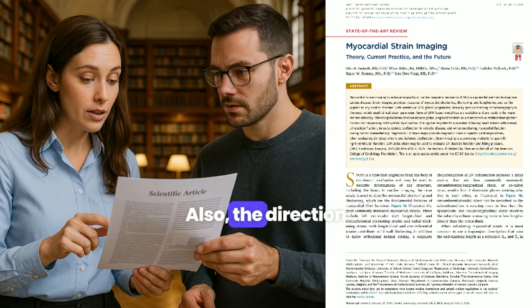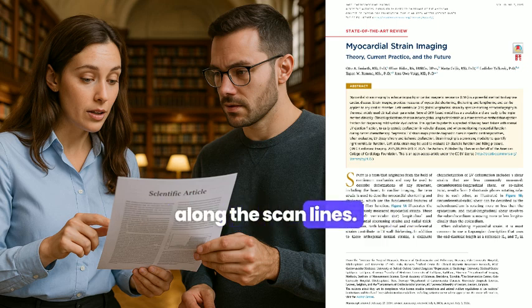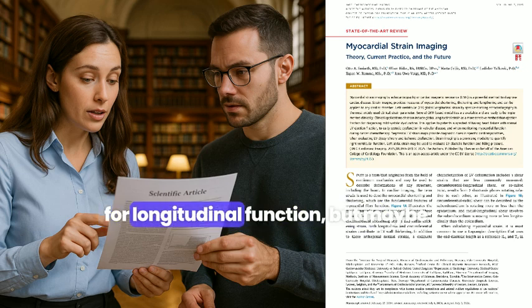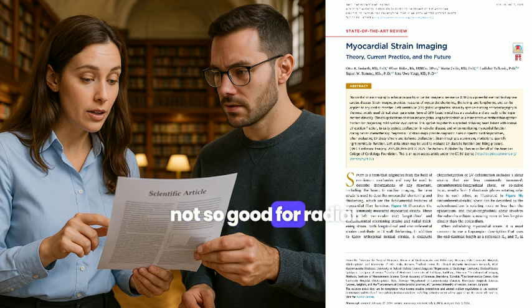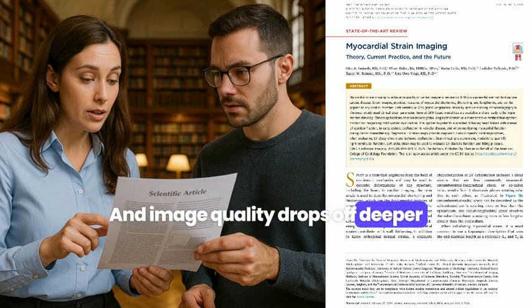Okay. Also, the direction of the ultrasound beam matters. Tracking is generally better along the scan lines. So apical views are great for longitudinal function. But maybe not so good for radial. Potentially less reliable, yeah. And image quality drops off deeper in the chest, naturally.